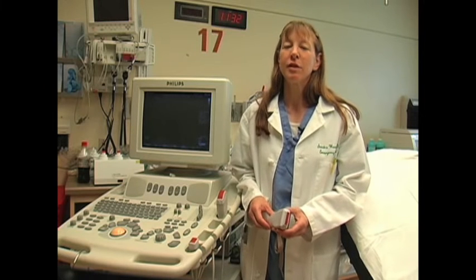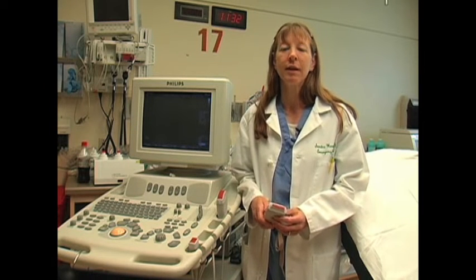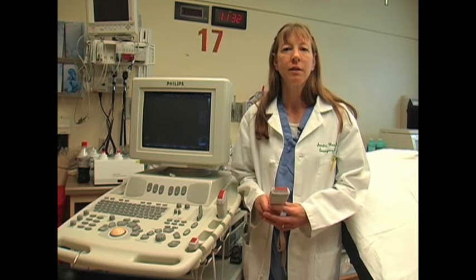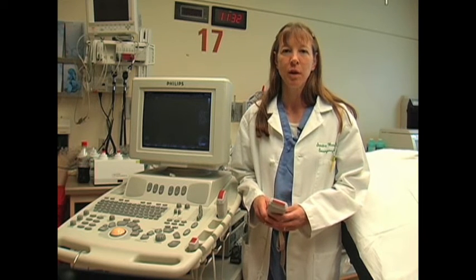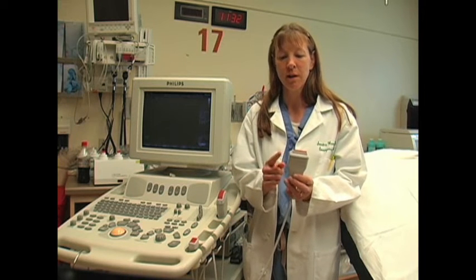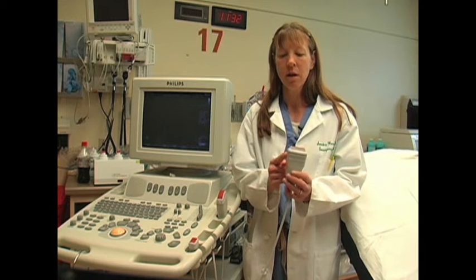So once again, we've seen how useful ultrasound can be in helping us see what's underneath the skin. In this case, differentiating cellulitis from abscess, so we can potentially avoid doing unnecessary incision and drainages on patients. Things to remember are just to keep the transducer in the proper orientation with the indicator towards the right or towards the patient's head. If you do that, you'll have no problem with this technique.